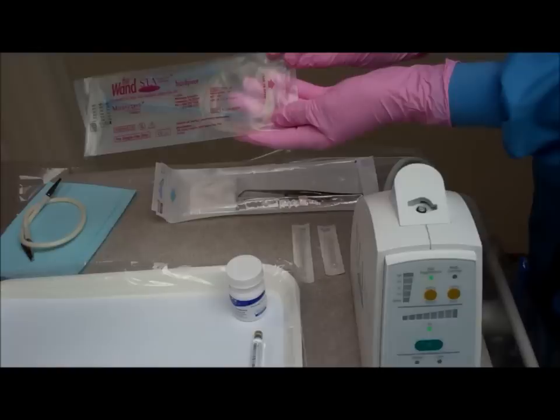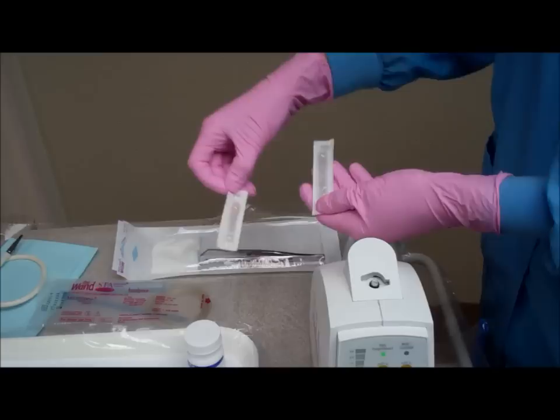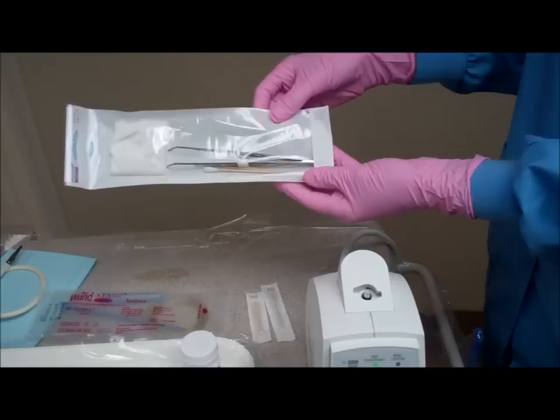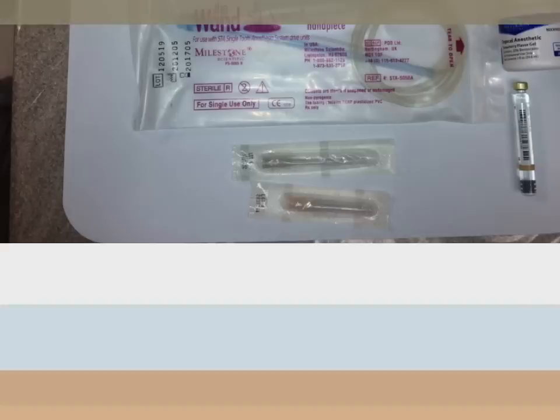Now we are going to discuss the armamentarium needed for the STA. We have the cord — some cords come supplied with the needle attached, but in this video the needle is not attached. We have two needles: the long and the short. We also have sterile gauze, locking tweezers or a hemostat, and cotton tip applicators. You will also need some topical anesthetic and the appropriate selection of anesthetic cartridge.